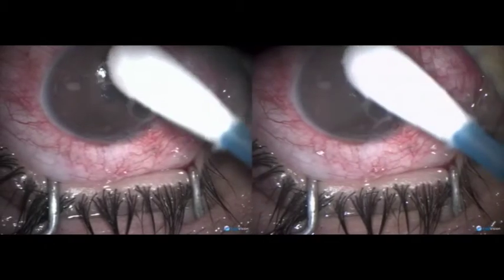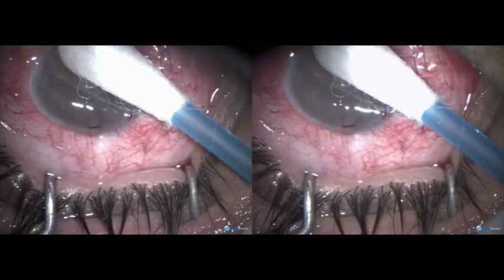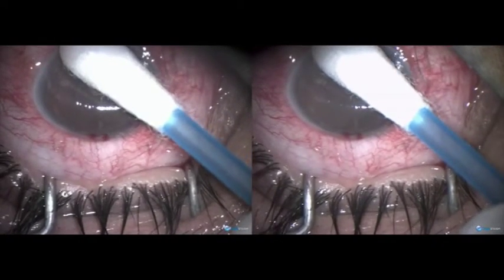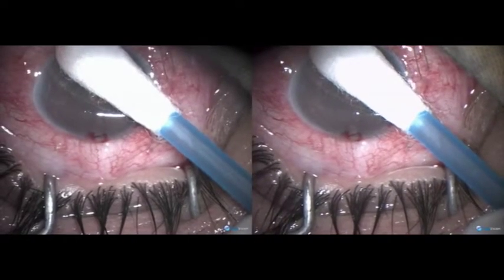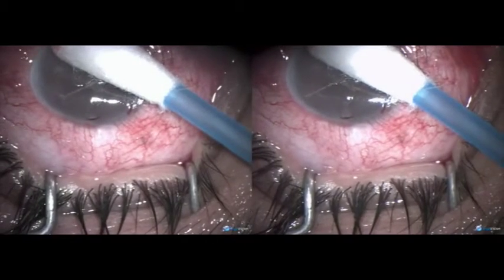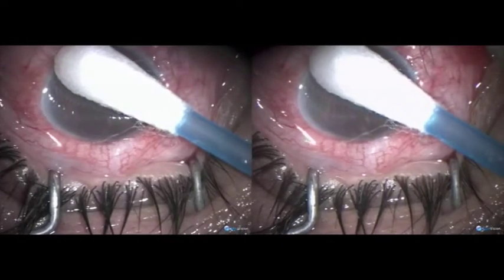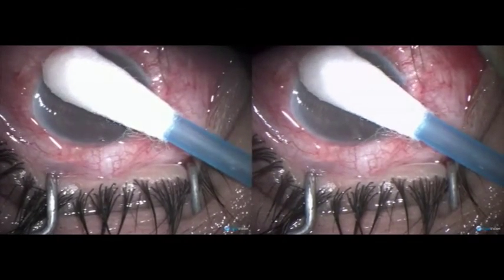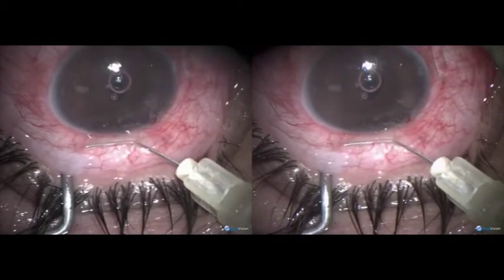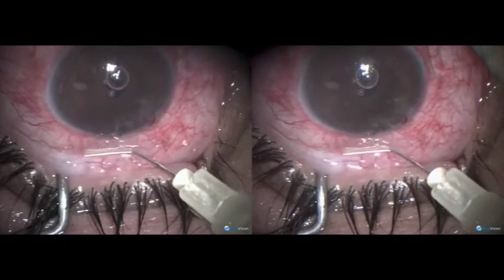Therefore, press the cornea and push out helon as much as you can so that the anterior chamber becomes shallow. You can then easily approach the iris with a fine iris forceps to do an iridectomy. All of this is attempting to remove helon and make the chamber shallow.